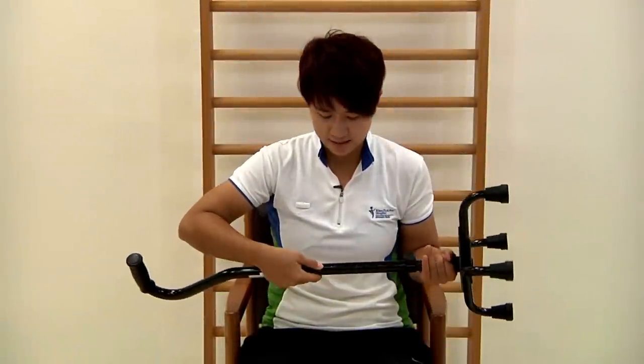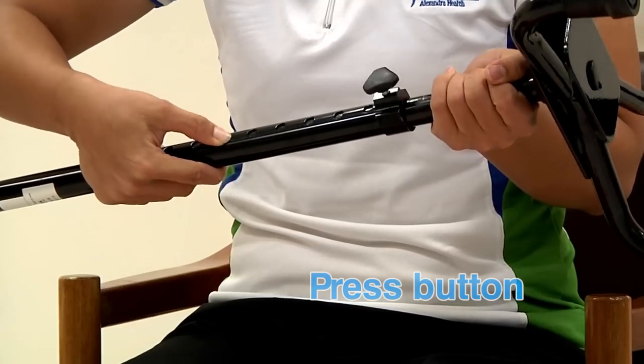To adjust the stick, first press the button and adjust the stick to the appropriate height.